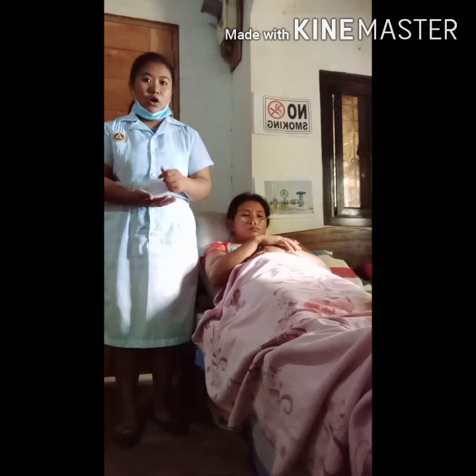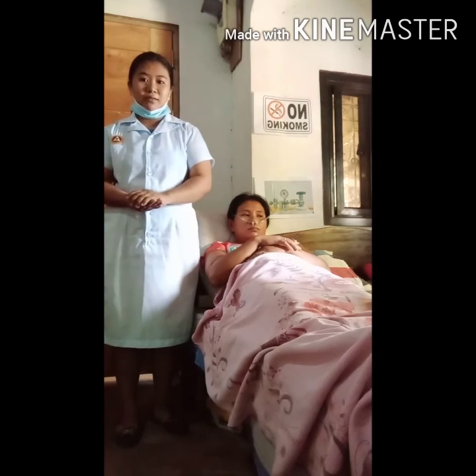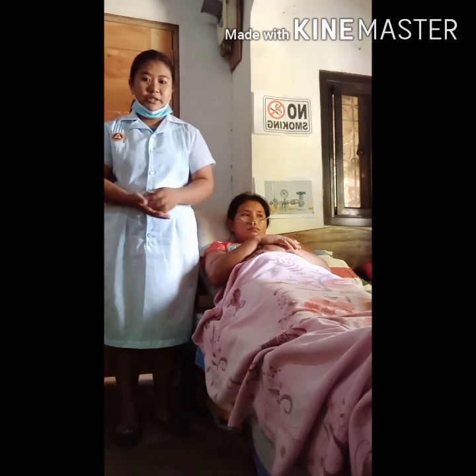And then for the recording and reporting, record and report all the pertinent information of the procedure. And then next is record pre-procedure and post-procedure vital signs, and then document the evaluation of patient or the caregiver learning.